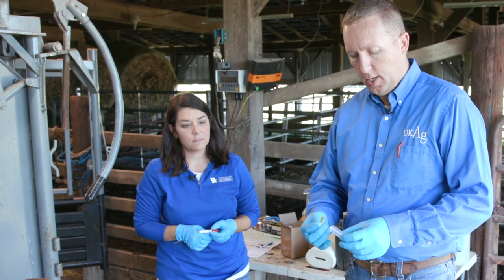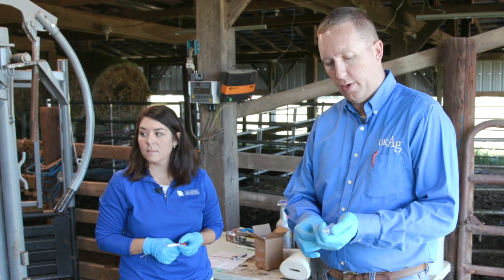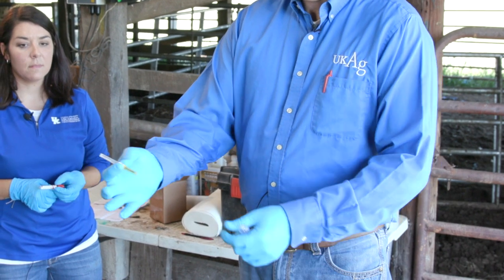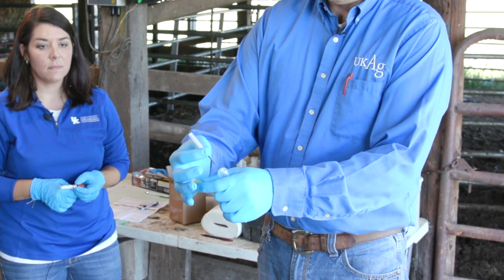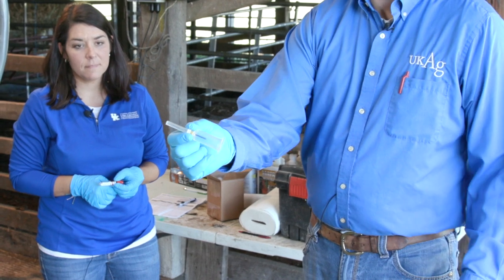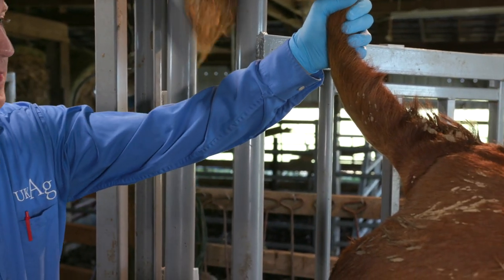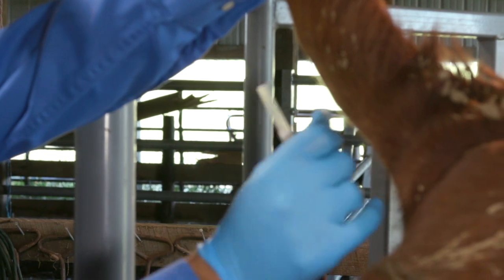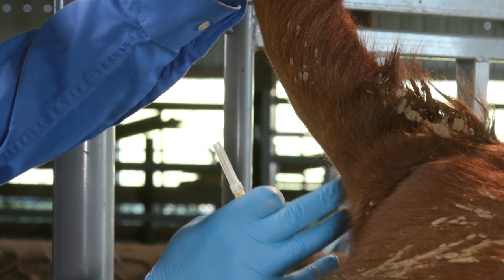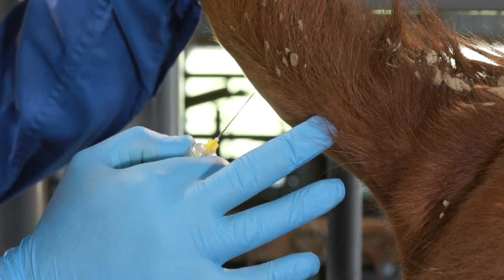We have our needle holder, which isn't required but makes things much easier for positioning. The needle has caps on opposite ends — we take the yellow cap with the rubber drain end and screw that into the needle holder. Moving to the back of the cow, we lift the tail straight up, feel for a couple of bumps — those are the bones — and find the valley between the bones in the center, which is where the coccygeal vein runs. We remove the needle cap and insert the needle at a 90-degree angle.